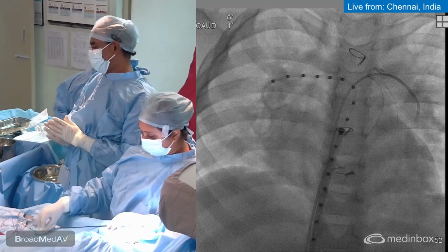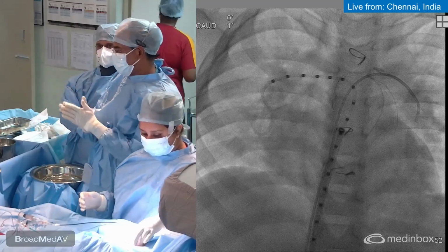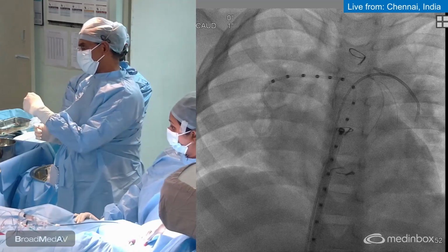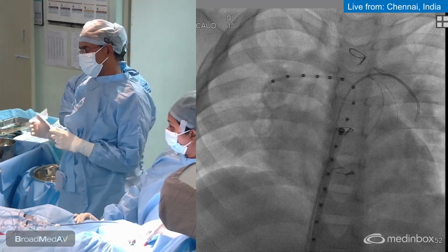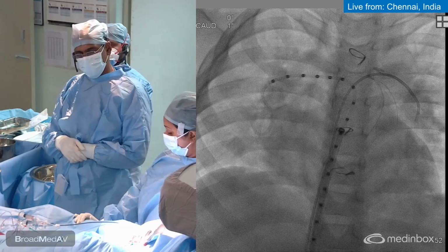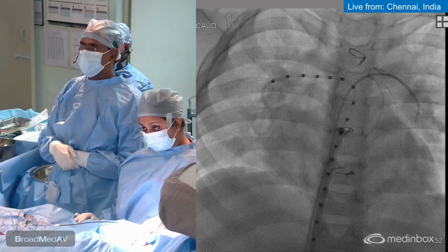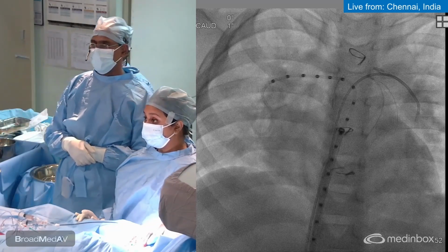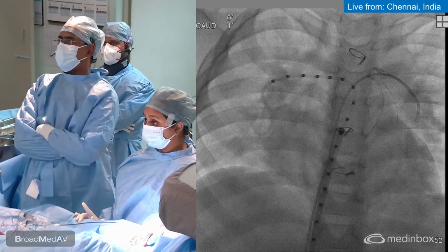That means we are basically going to form a carina from the pulmonary trunk into both the branch pulmonary arteries. The stent of the right should not come into the path of the left. So we may be able to position the stents better if we have bilateral venous access. And as I speak now, we have connected the left pulmonary artery and the right ventricle.